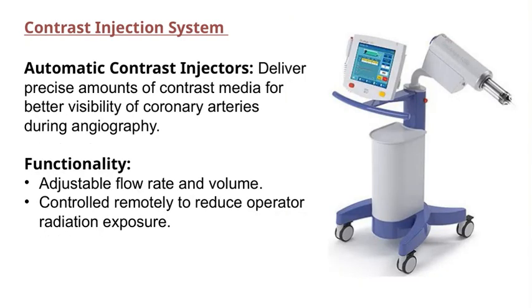Let's take a closer look at the contrast injection system. These automatic contrast injectors are designed to deliver precise amounts of contrast media, which is crucial for achieving better visibility of the coronary arteries during angiography. The key here is accuracy. By controlling the amount of contrast, we can obtain clearer images and more accurate diagnoses.